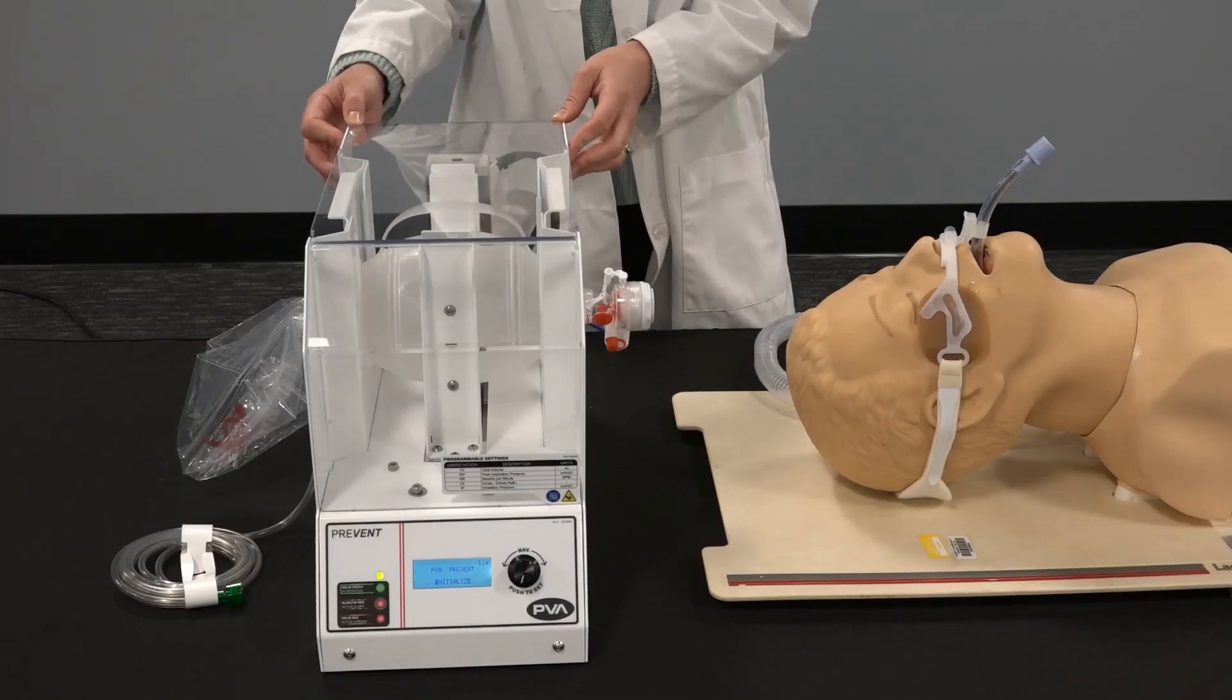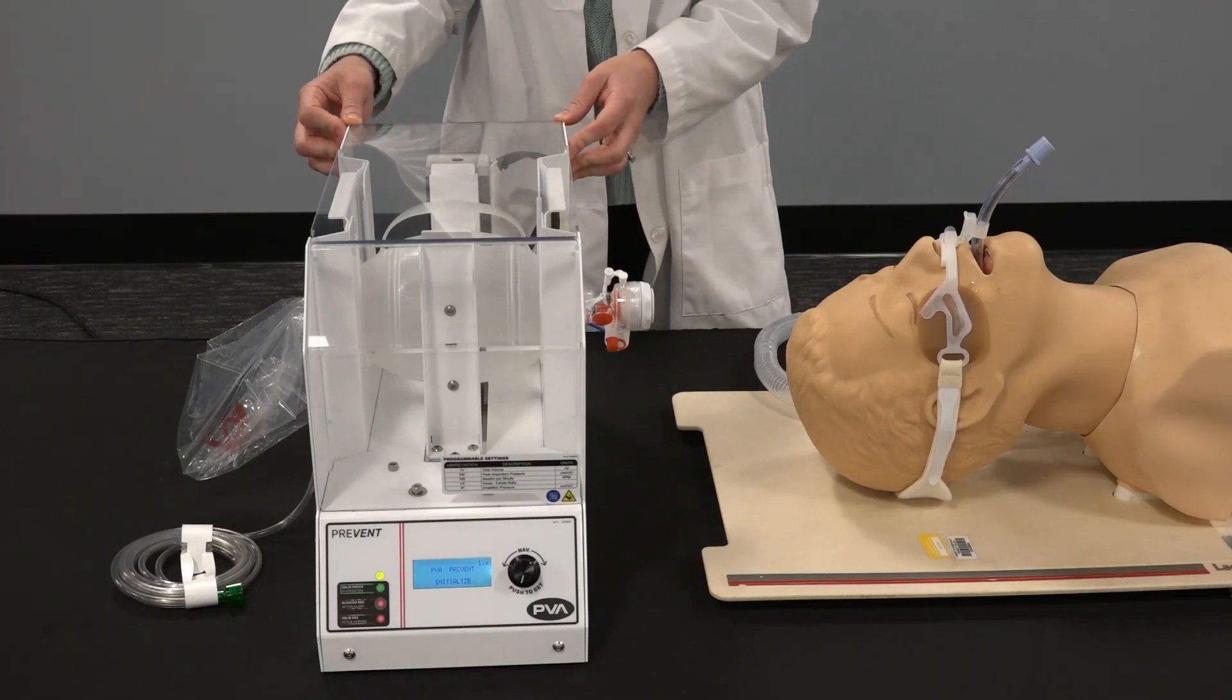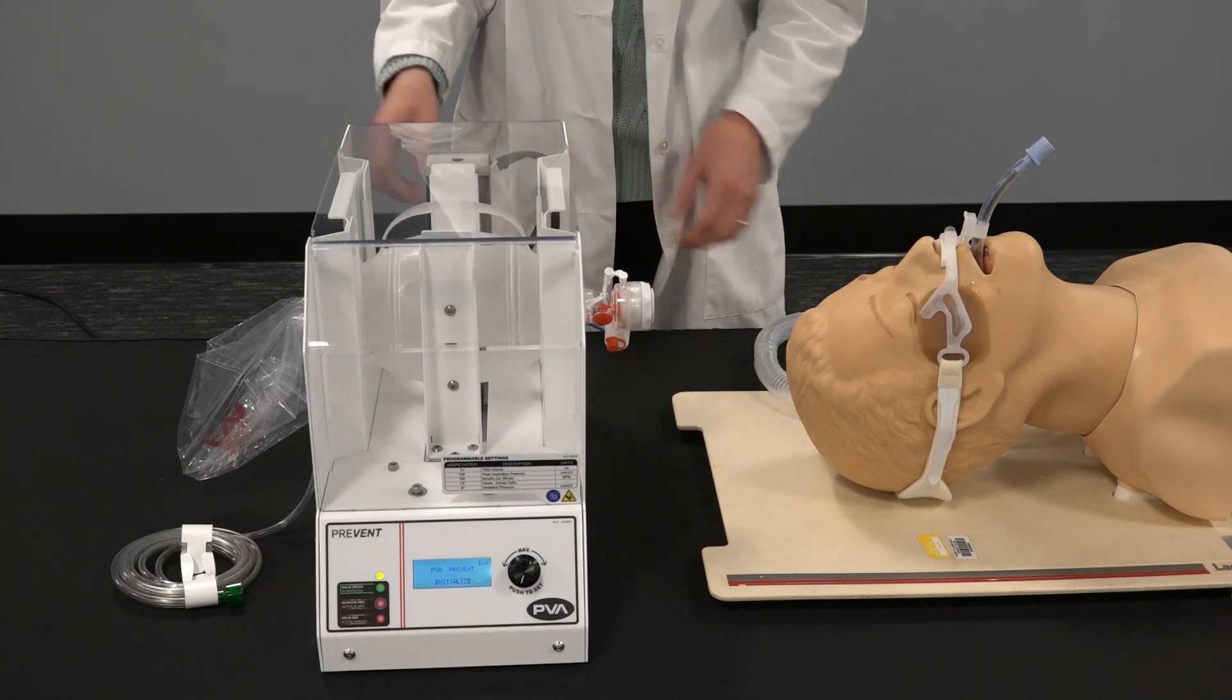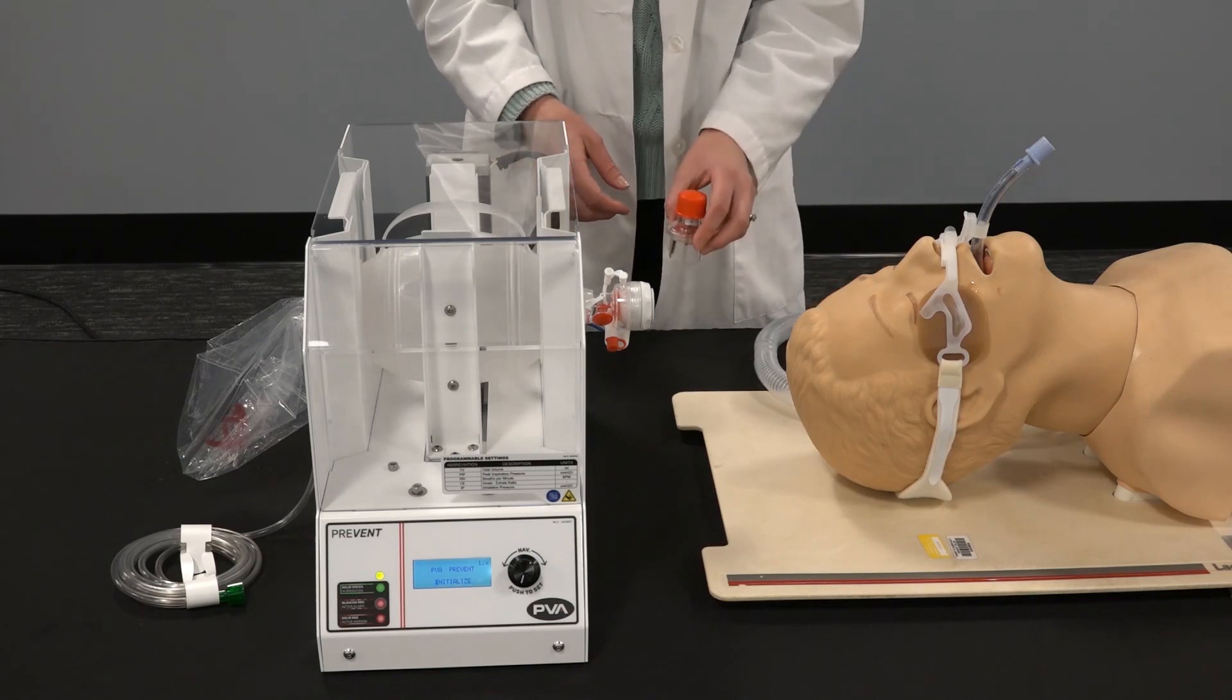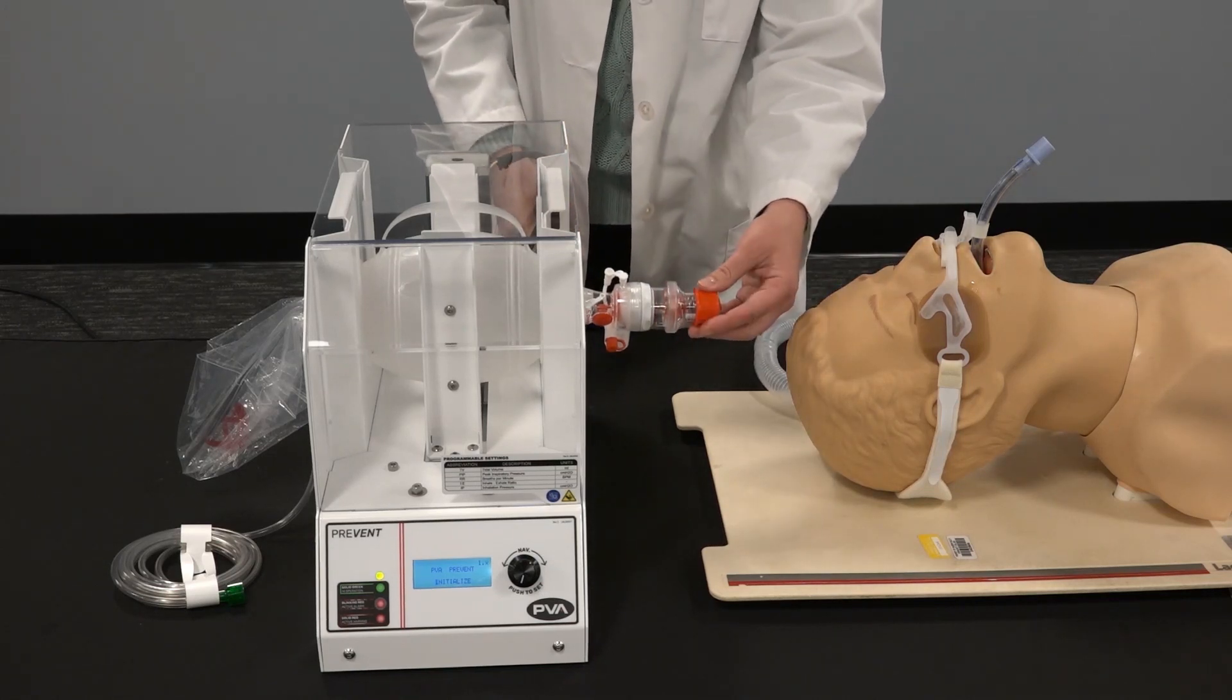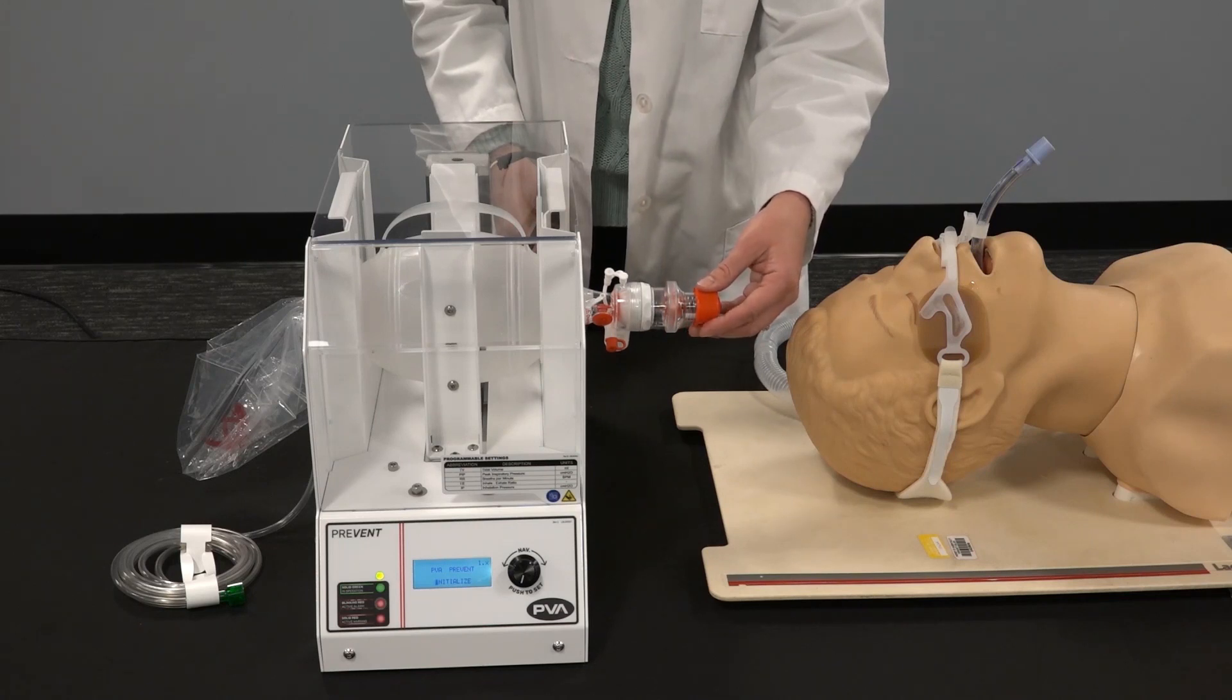Once the resuscitation bag has been installed and the power supply connected, you are ready to complete the rest of the breathing circuit. First, take the peep valve. Place the peep valve at the end of the resuscitation bag and set to your desired parameter.